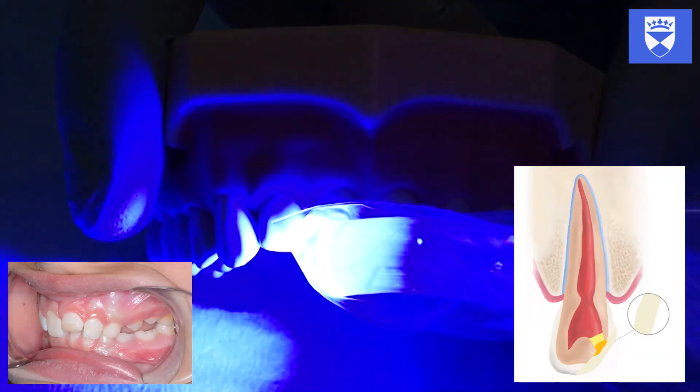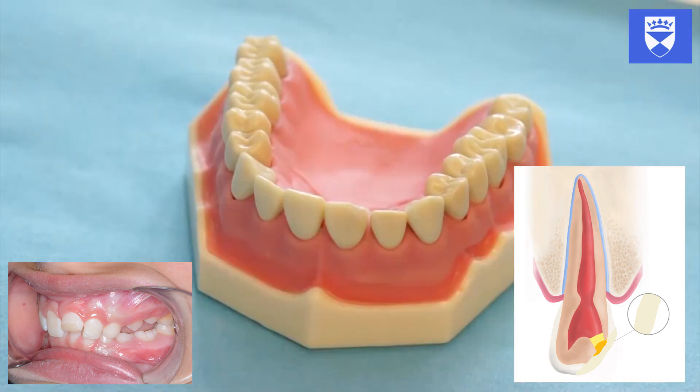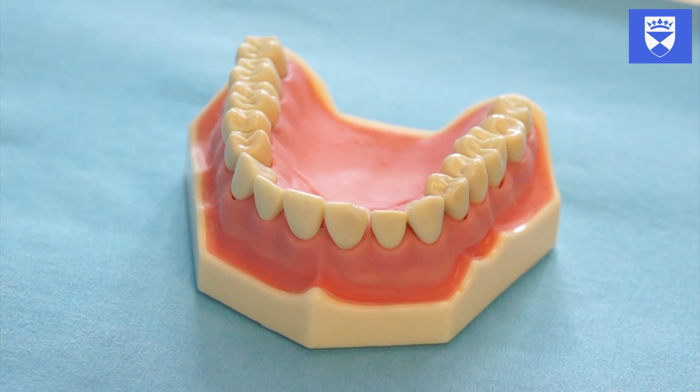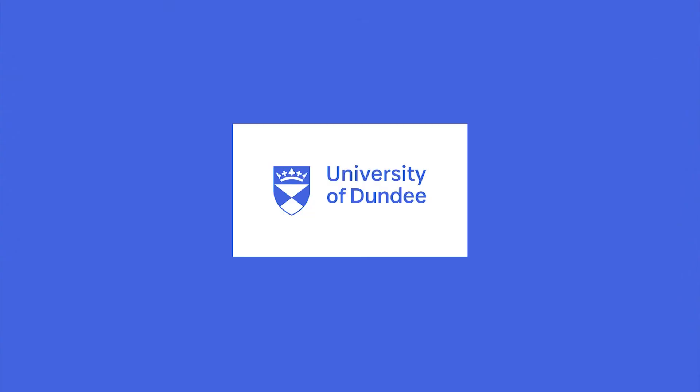It is important that your composite bandage does not interfere with occlusion. Use articulating paper to check both static and dynamic occlusions. Finally, floss the contacts to ensure that no bond has become stuck in. The definitive restoration of this tooth will be covered in a separate video.